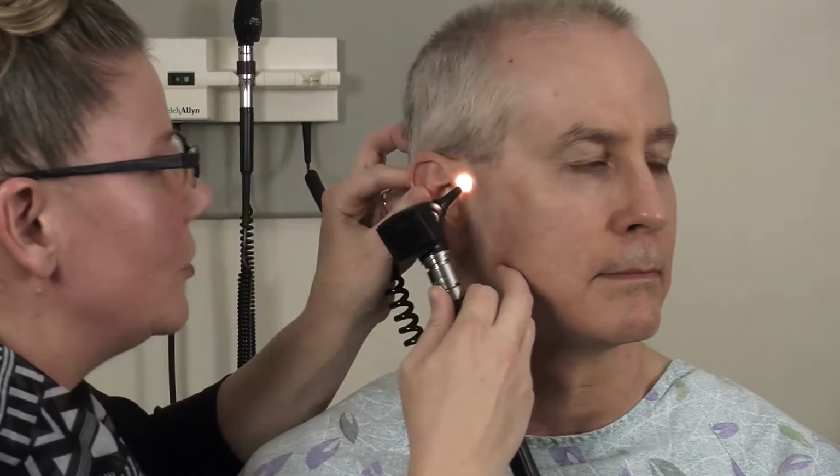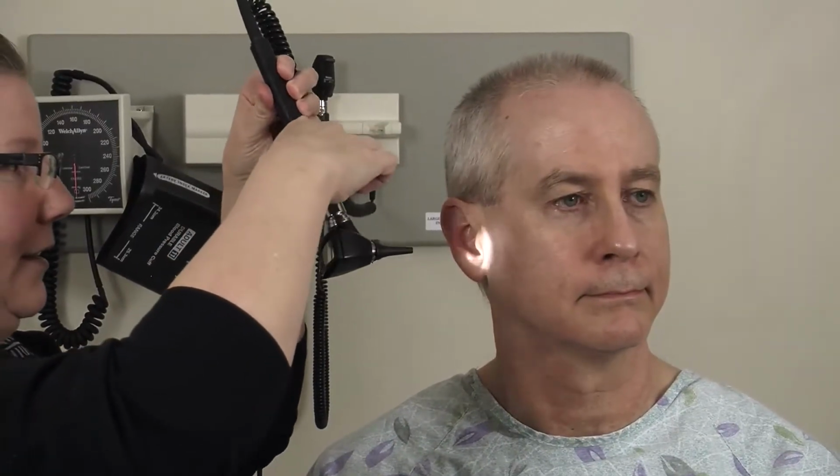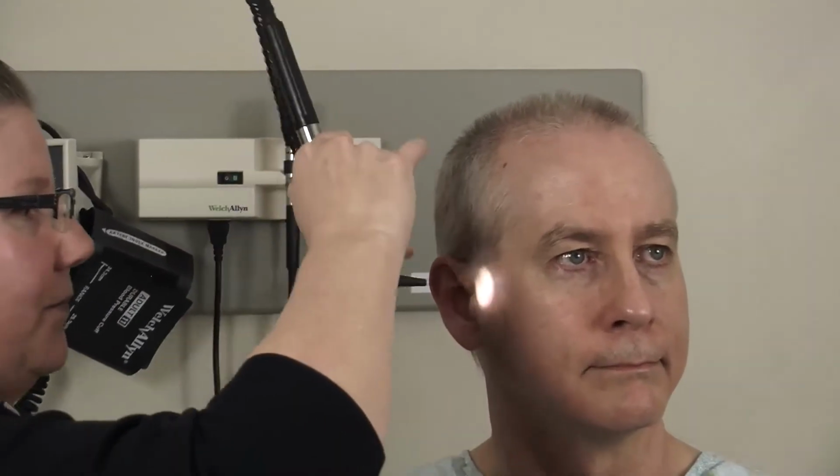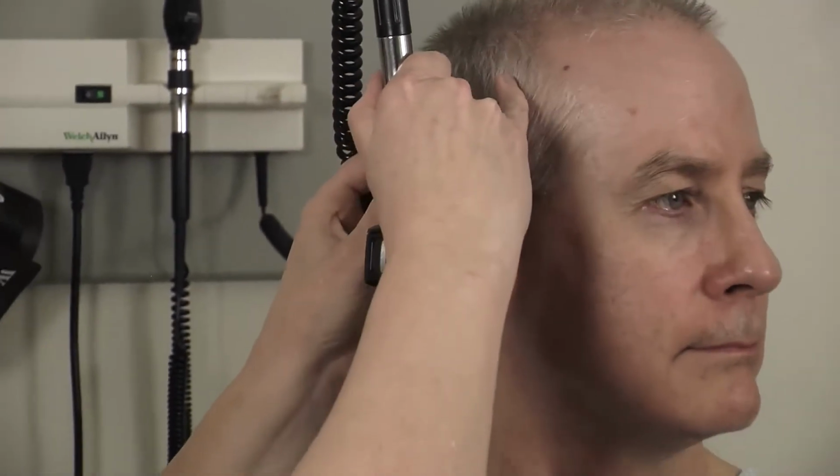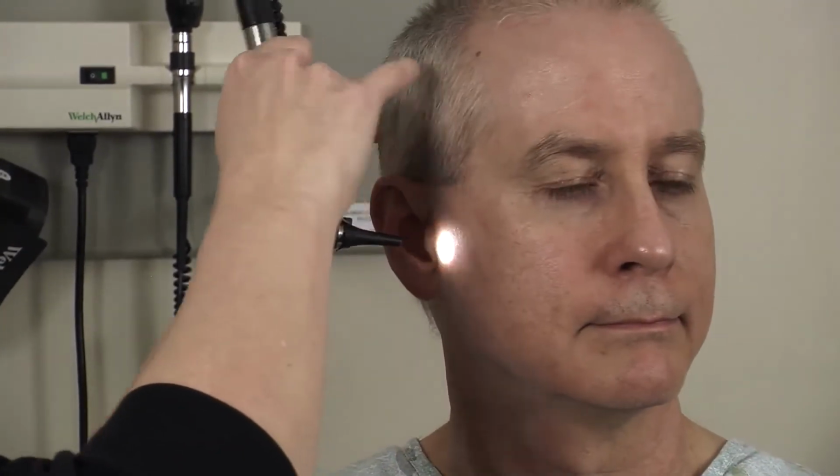So when Steve moves, my otoscope will move with him. The other way is using it almost as a pencil. You can go this way and brace. Again, bracing your fingers against the head helps, so that should Steve move, my otoscope is going to move with him.